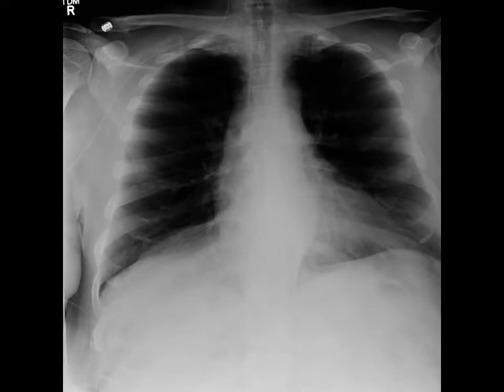This patient's a 74-year-old female who was admitted for bacteremia secondary to a foot ulcer, past medical history of diabetes. A PIC was placed and then a chest x-ray was taken to verify position.